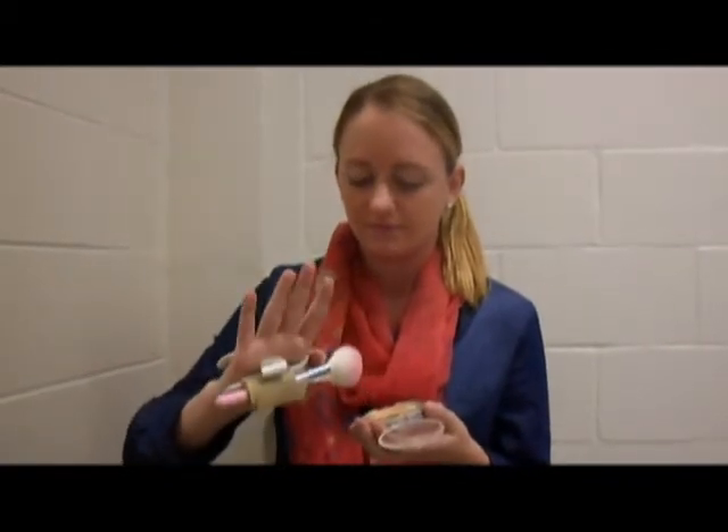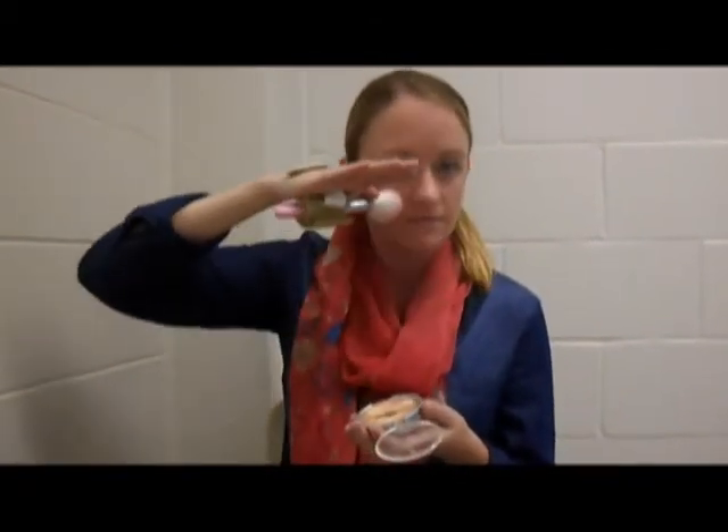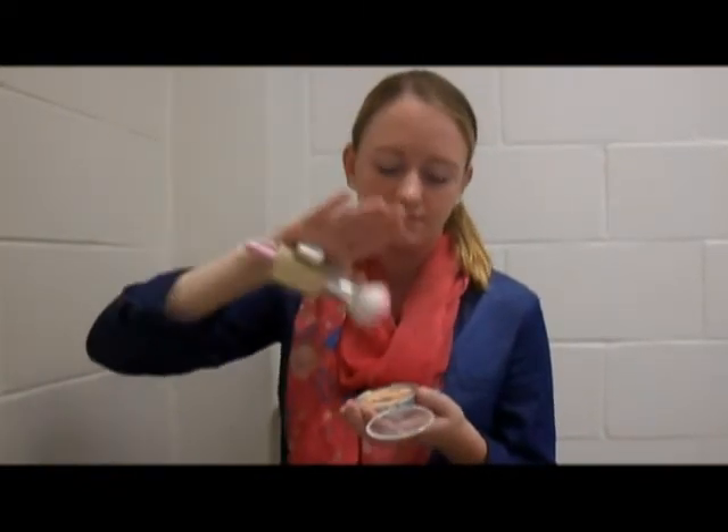Lauren will now demonstrate how a client with a C6 spinal cord injury can employ tenodesis to use the device to complete the following grooming tasks.